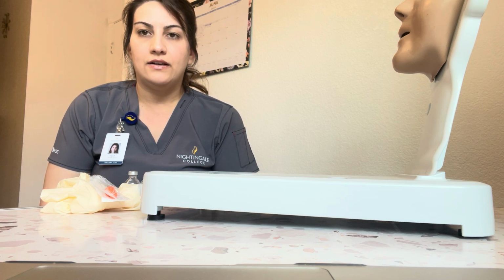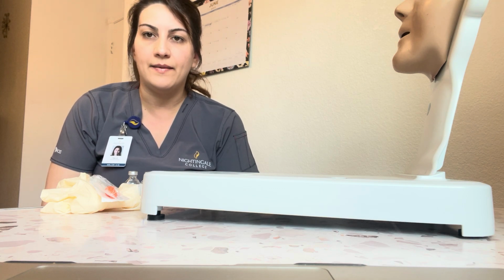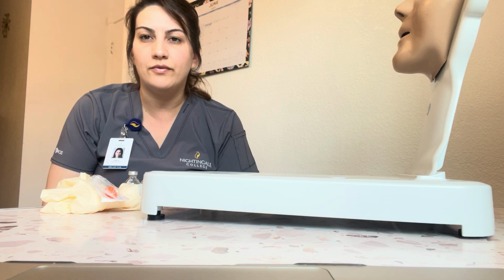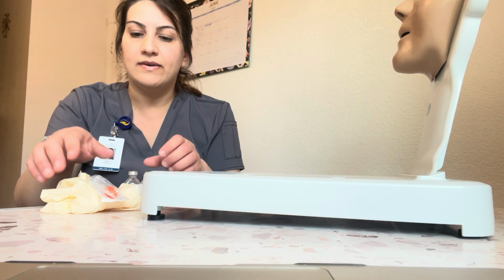Basically, a patient is going to be receiving insulin. It's going to come in one form, an injection of the regular, which is 4 units, and then we're going to have the intermediate, which is 8 units, which is going to totalize to 12 units of insulin. I will next gather my supplies here.